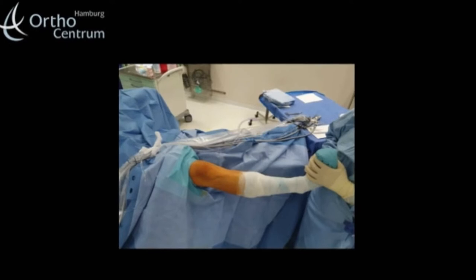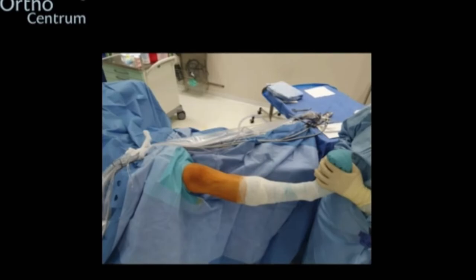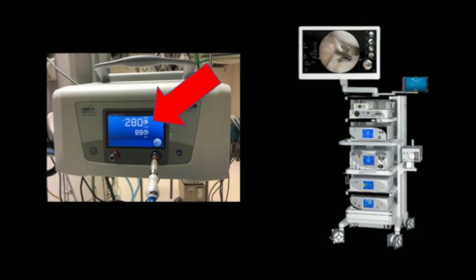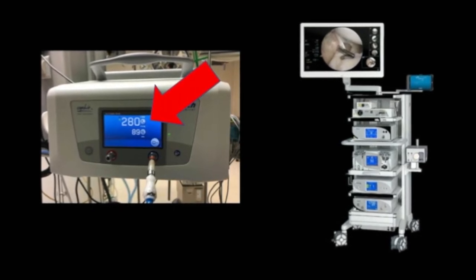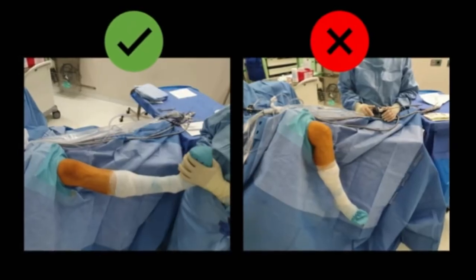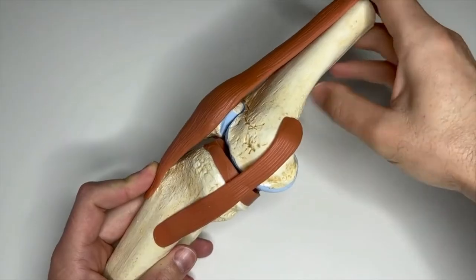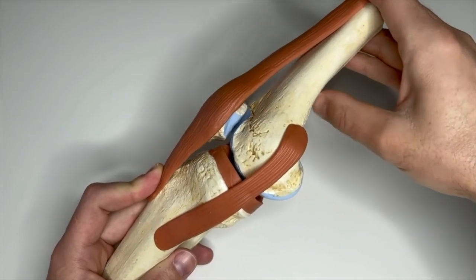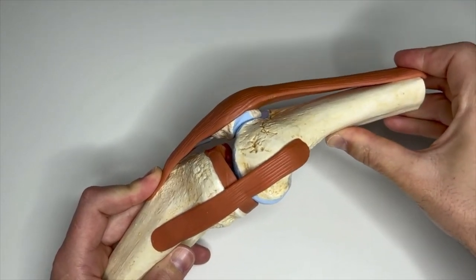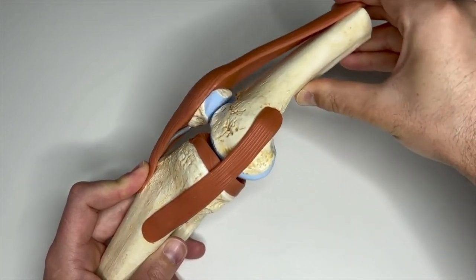The patient is in a supine position. The femur is fixed in a leg holder, and the use of a tourniquet with a pressure around 280 mmHg is recommended because you want to implant the cartilage cells without any fluid. The leg should be extended completely because the more the knee flexes, the higher the pressure in the patellofemoral joint. Due to the narrow joint gap, it is recommended to keep the pressure as low as possible to obtain the greatest possible distance between the back of the patella and the trochlea, which is necessary for the implantation of cartilage chips.